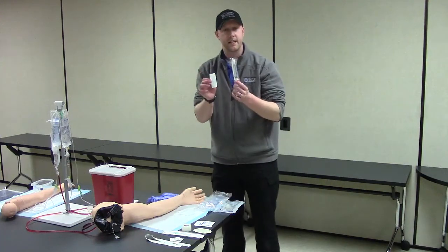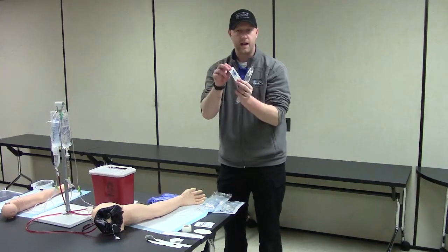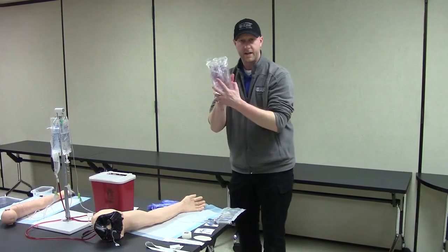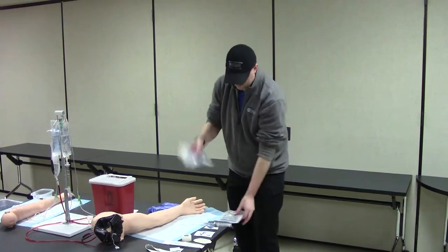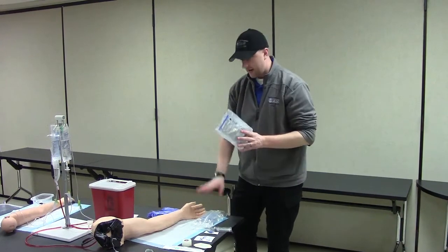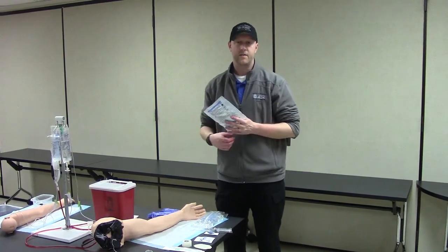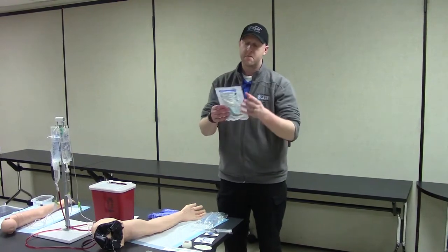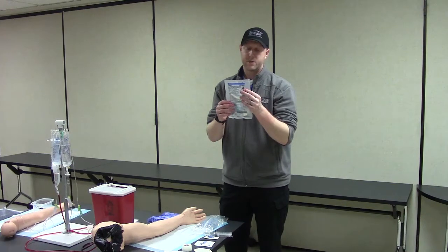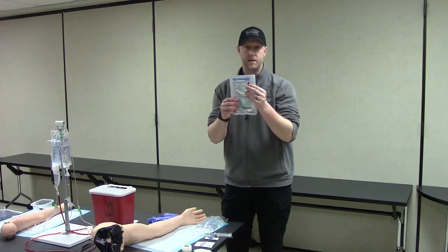Today we're going to be starting a saline lock, so I have my saline flush syringe and the actual lock. And then if we need to run fluid, I have my saline — a 500-milliliter bag — as well as my drip set. So I have normal saline; it might be lactated ringers, it might be D5W depending on your patient. Same thing with the drip set — I'm using a 10-drop set today, which means 10 drops equal 1 milliliter of fluid.